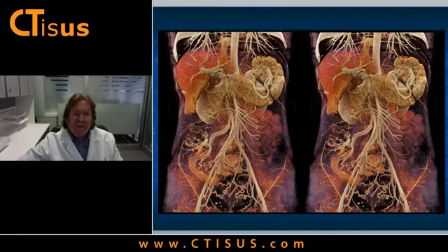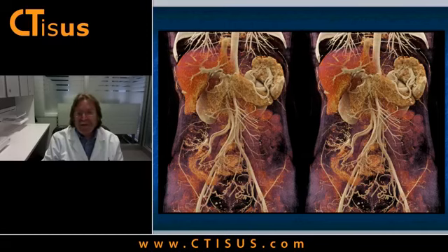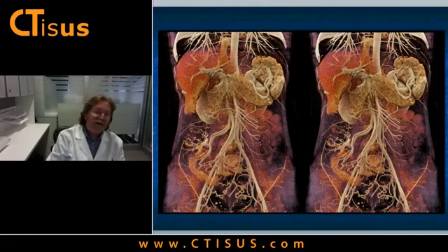So one of the things we look at, and you can see in the last two cases, shows how good it is for looking at soft tissue. You can see specific organs: spleen, liver, kidneys, pancreas. You can see the difference between normal tissue and abnormal tissue. In the same scene, you can see very nice vascular mapping, including the prominent enhancement. So you get a really good feel of looking at that. You also can see the detail of muscle and bone.